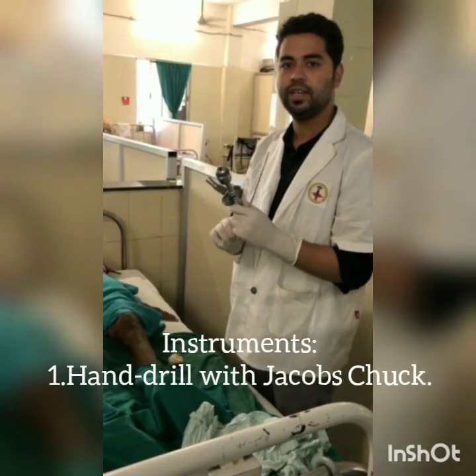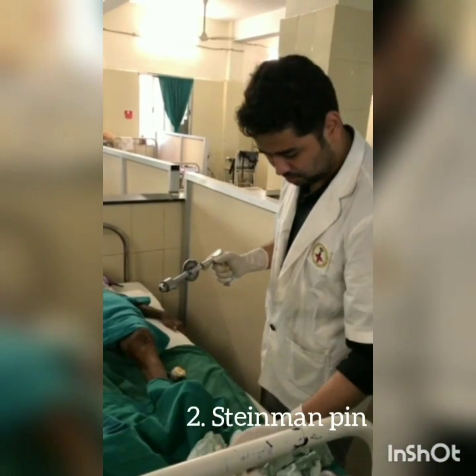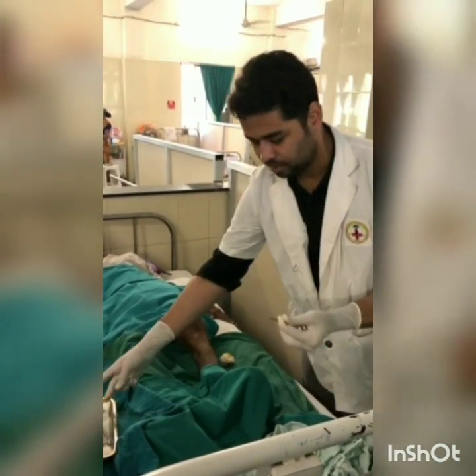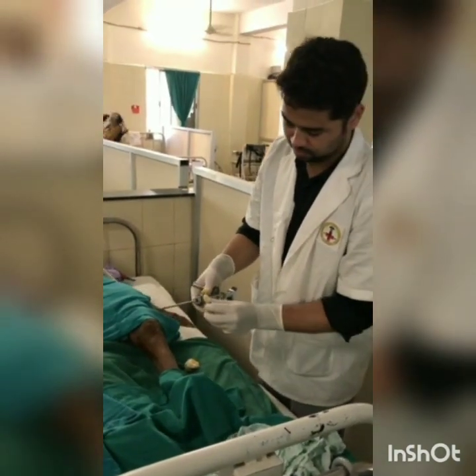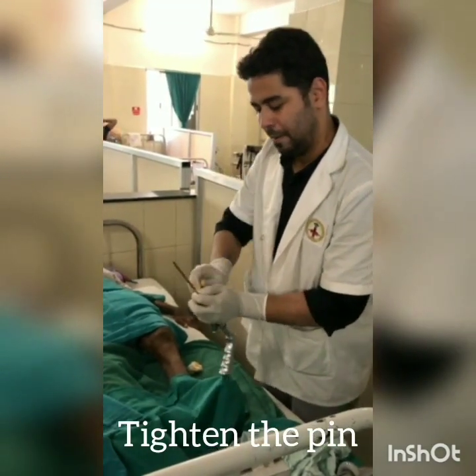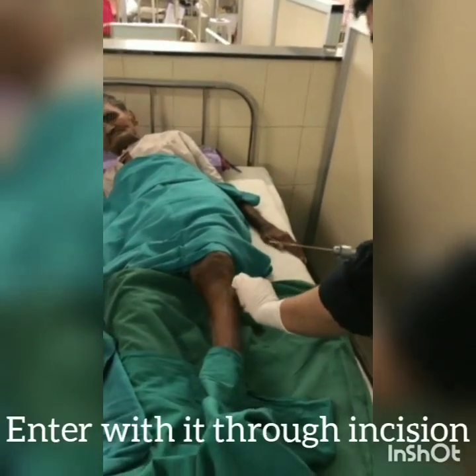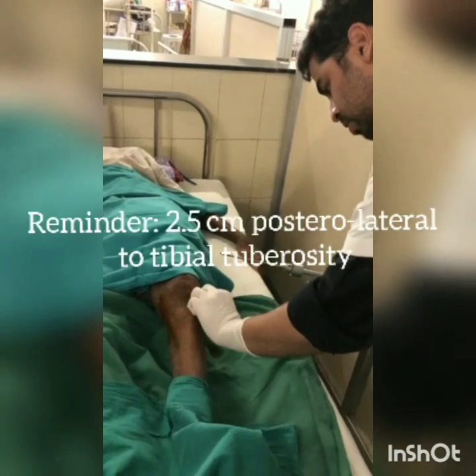This is a hand drill with Chekopsan's chuck, and this is the Steinmann pin which we are going to insert. We have to clean the Steinmann pin with betadine, then insert it into the hand drill. This is the key with which I am tightening the pin. We have to go through the entry side, which is 2.5 cm lateral and posterior to the tibial tubercle.